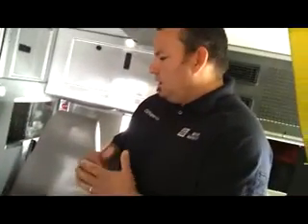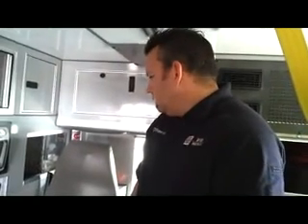This compartment down here, we just have IV catheters kind of on the fly. If we need to start an IV real quick, we can grab anywhere from a 22 gauge all the way up into a 16 gauge. 22 being a smaller needle, 16 being a bigger needle. On a trauma patient, if they need fluid fast, we'll try to use a bigger gauge needle.